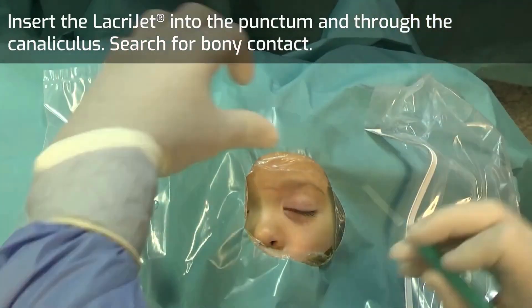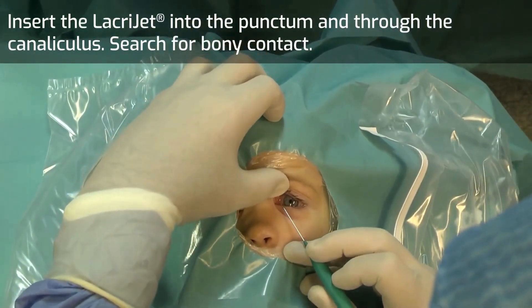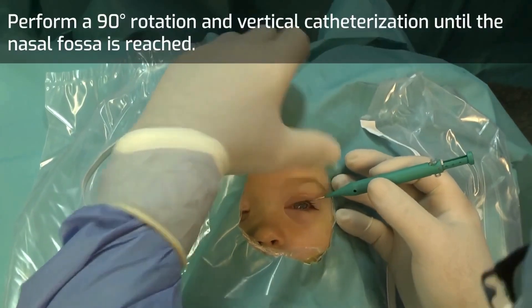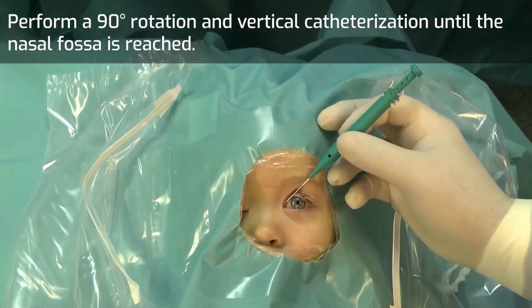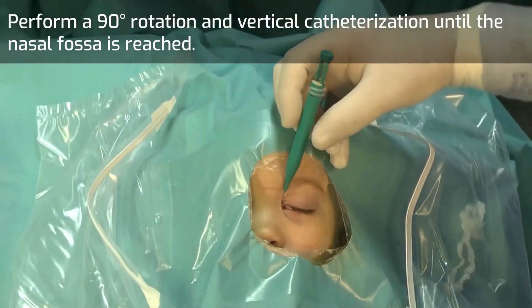Insert the Lacrijet into the punctum and through the canaliculus. Search for bony contact, then perform a 90-degree rotation and vertical catheterization until the nasal fossa is reached.